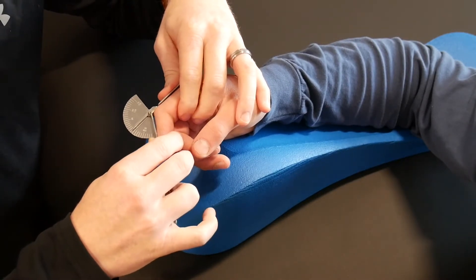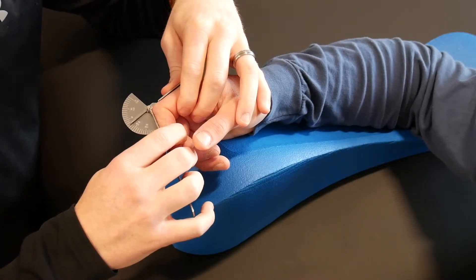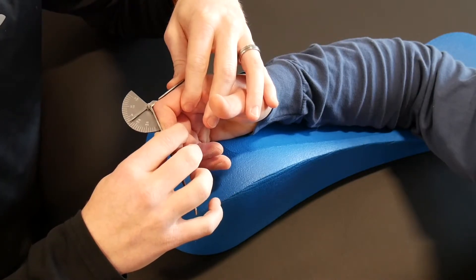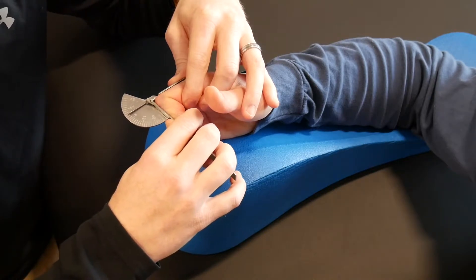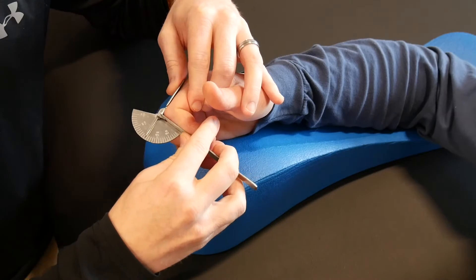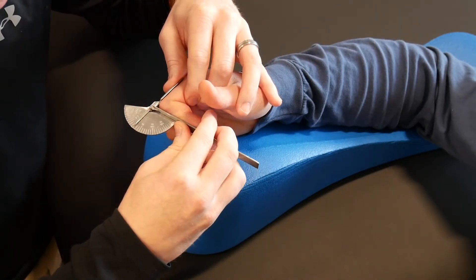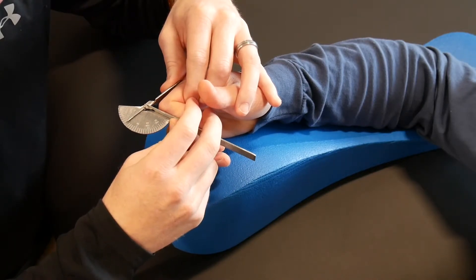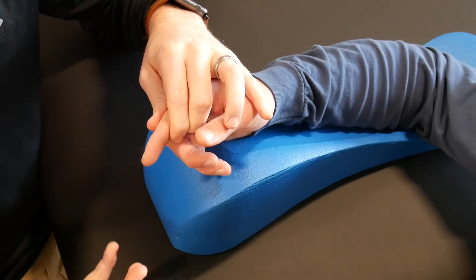If he didn't have normal motion, I'm going to apply the same principles as measuring passive MP joint flexion — just push the finger and the goniometer simultaneously to get my measurement. One thing you want to make sure doesn't happen when you're doing this is the bowing of the goniometer right at the axis, because that will skew your measurement.